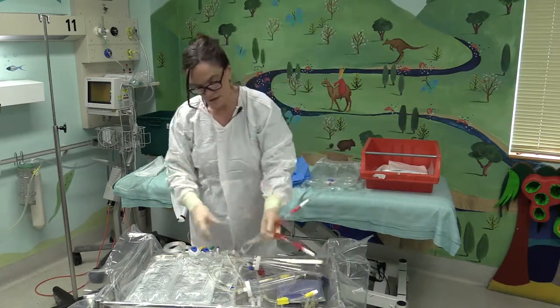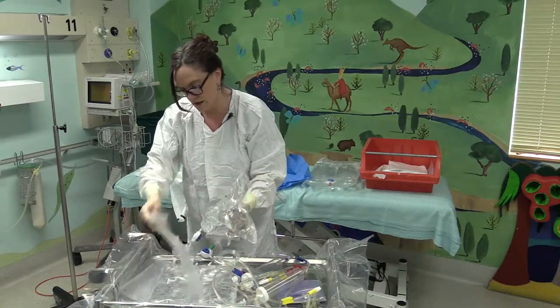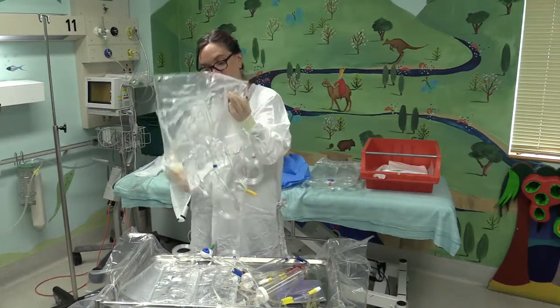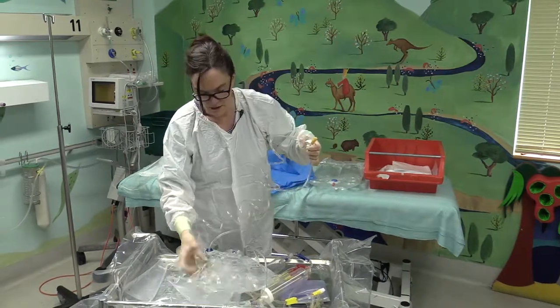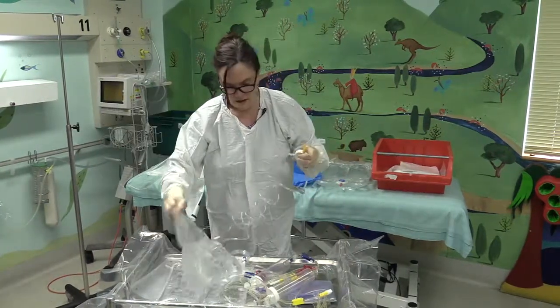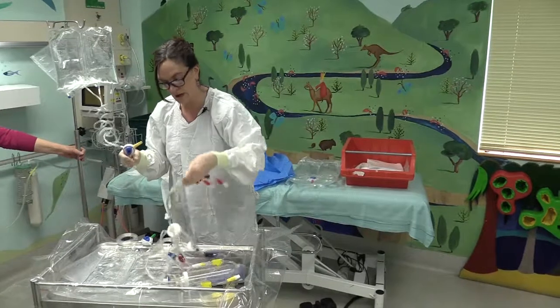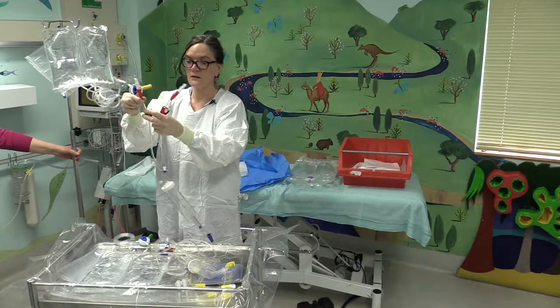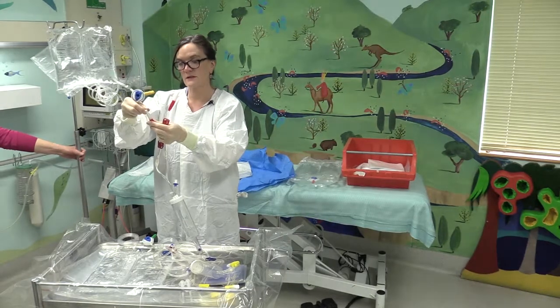Okay. So what I might do, just to make things easier, it's a little bit complicated, I'll hang the bags onto the IV pole. So I just need to unravel this tubing. So I'm going to hang that to my assistant, where we can possibly contaminate, so just be very careful. I'm going to attach it. I'll close that clamp first. I'm going to attach it to this giving set.